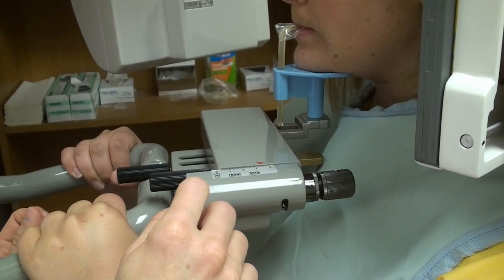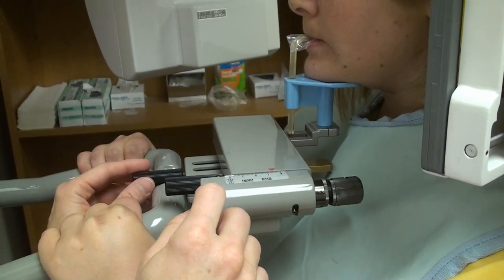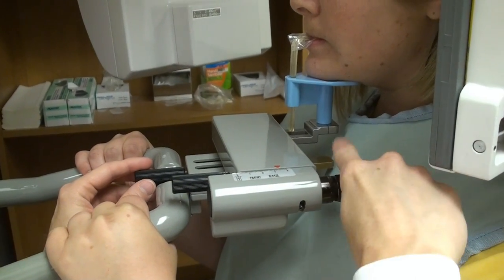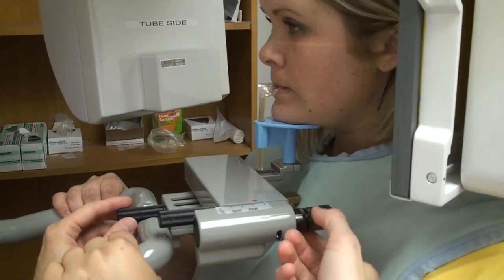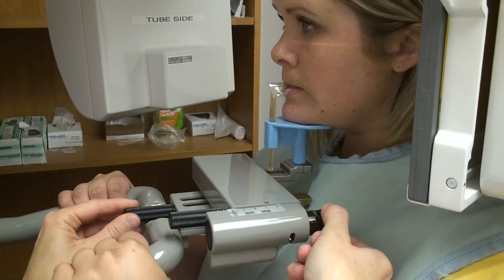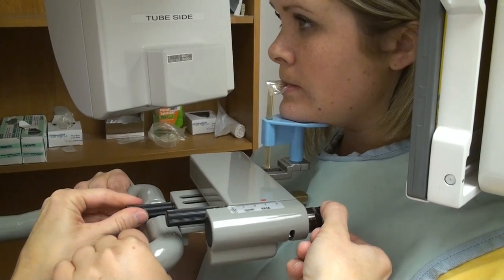The mid-sagittal plane — we want to make sure it's right down the middle of her face. Lindsay, make sure you're still facing straight forward; that line is right down the middle of your nose. That looks good. The last thing we're going to do is the focal trough. Find the light with your right — all the way to your right is where you're going to find the light. Be careful not to put your finger over it because the light comes out right here, so put it under. Find the light with your right hand.